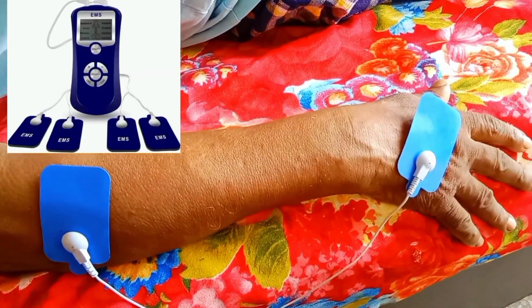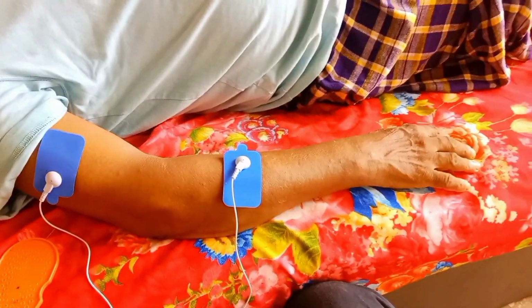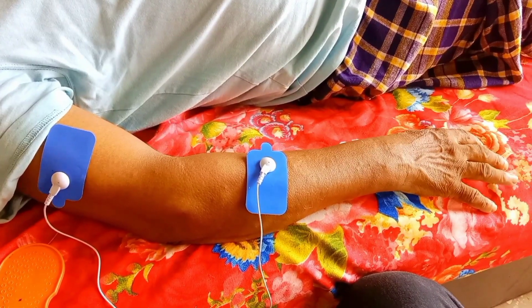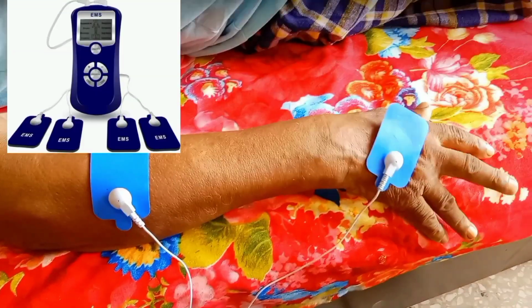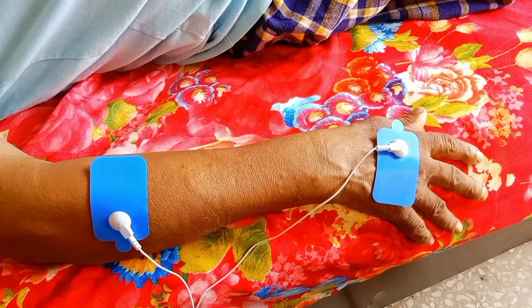Electric muscle stimulator is a device that uses electrical impulses. EMS functions: stimulate muscle contraction to improve muscle strength and tone. EMS helps to relax muscles and reduce muscle spasm. It can help alleviate pain by stimulating the release of natural pain relievers.